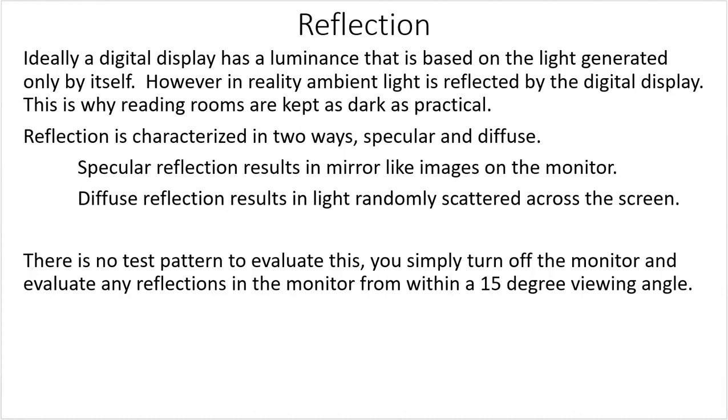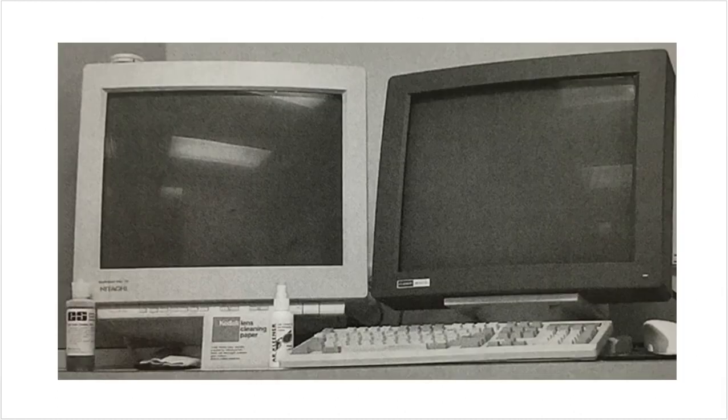There's no test pattern to evaluate this. You simply turn off the monitor and evaluate any reflections in the monitor from within a 15-degree viewing angle. You want to use viewing angles.